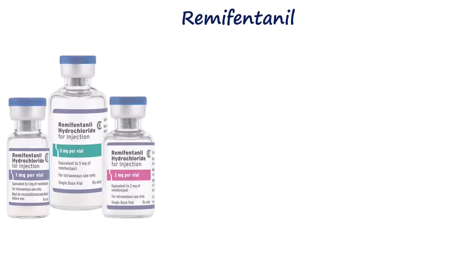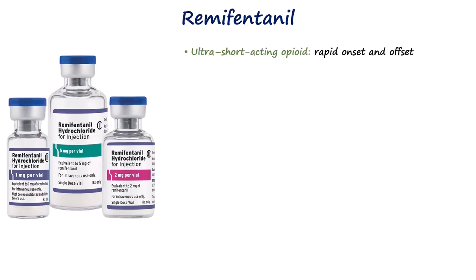Remifentanil is another very useful drug for awake fiberoptic intubation. It's an ultra-short-acting opioid, which means it comes on very quickly and also wears off just as fast. The reason we like remifentanil is that it gives strong analgesia and, at the same time, suppresses coughing. This makes it much easier to pass the scope smoothly through the airway.